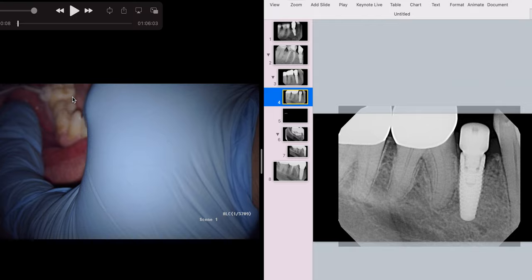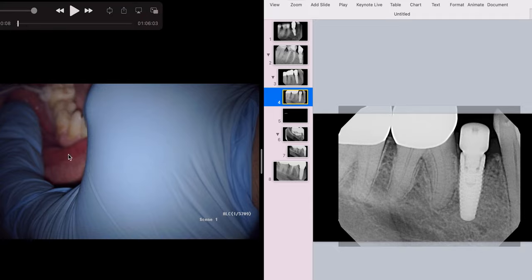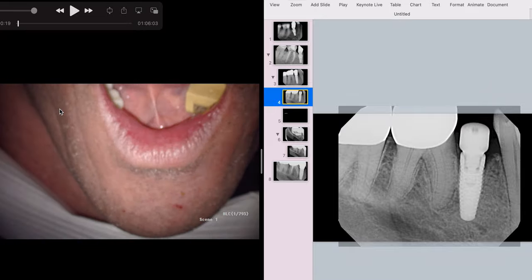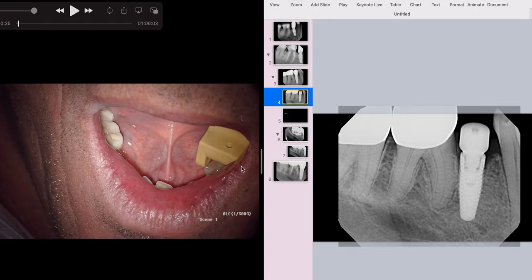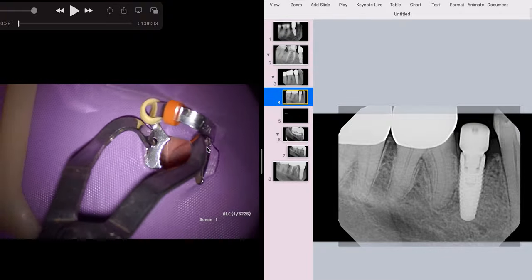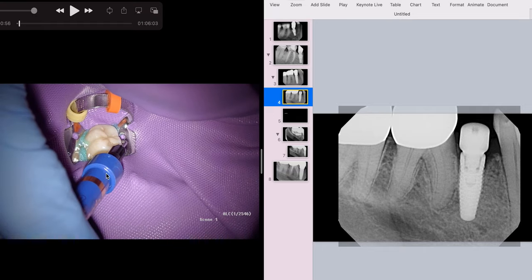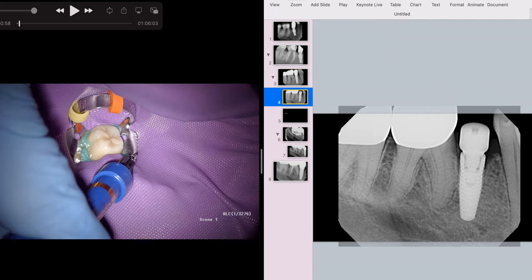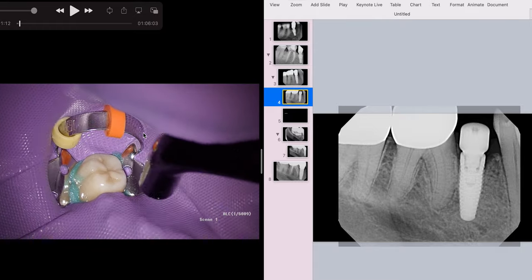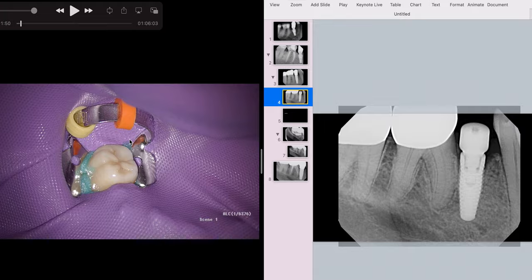After giving three blocks — my standard is three blocks to make sure we cover everything — I cold-tested again. The patient said his lip was numb, but I verified with a cold test. He was cold-test negative, so we placed our rubber bite block. I encourage you to use one — most people do well with them. Then we placed our rubber dam and our secondary seal. I've been using Aura seal instead of opal dam now; opal dam flicks off. After six years of testing it, Aura seal is great because it's silicate-based and stays on.